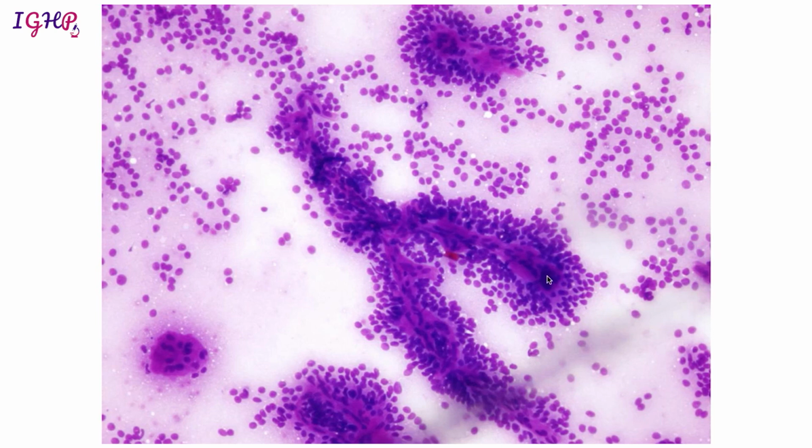An important differential of SPEN will be neuroendocrine tumors. In neuroendocrine tumors, the cells again will be monotonous, but they will not show these definite papilloid fragments that are usually seen in SPEN. In addition, you can get your immunomarkers done on the cell block, especially for PR, CD10 and beta catenin, along with the neuroendocrine markers, which will be positive in SPEN. So this is again a neoplastic lesion, which is a solid pseudopapillary neoplasm.